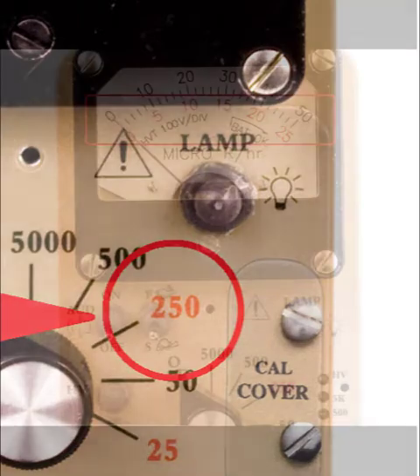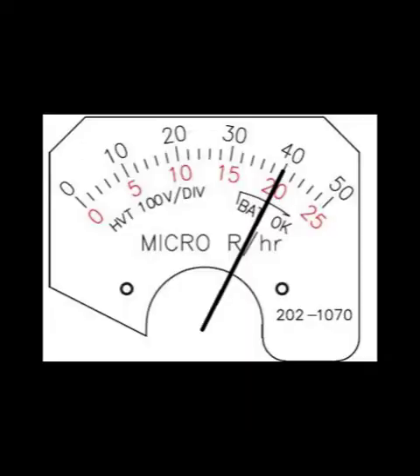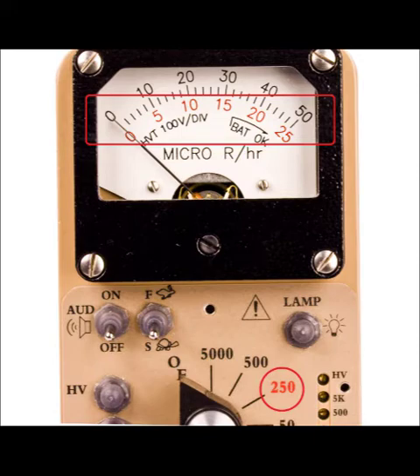The next range position is 250, which measures from 0 to 250 micro-R per hour. You must use the bottom scale of the meter and add one zero to the reading, so if the needle points to 20, it is reading 200 micro-R per hour on that range. Note that the numbers on the range switch correspond to the color of the numbers on the meter display — the numbers are red in this instance.